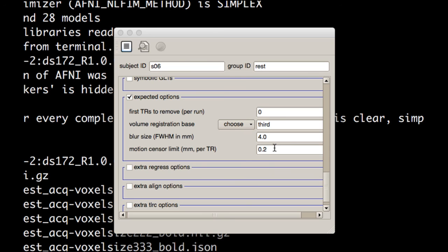So what that means, the default in AFNI is to replace each of those censored time points with a zero. Other options are to either just cut it out and thereby shorten the time series by that number of TRs that you censor, or to do some kind of interpolation and leave the time series length the same. The other option, the default, like I mentioned, is to replace it with a zero.